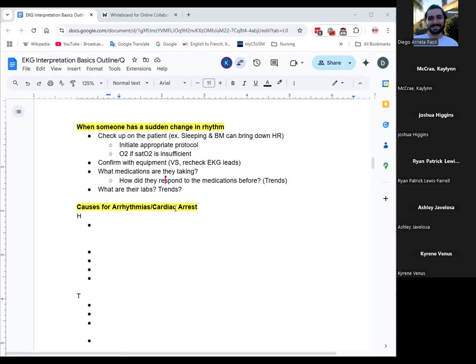And then also flush after, because the IV line has a little bit coming out of the patient, and if the medication's still in there, they're not getting the full dose. So that's why you flush, to make sure everything inside the line is in the vein. The little pigtail.